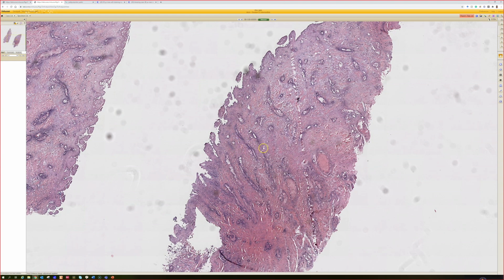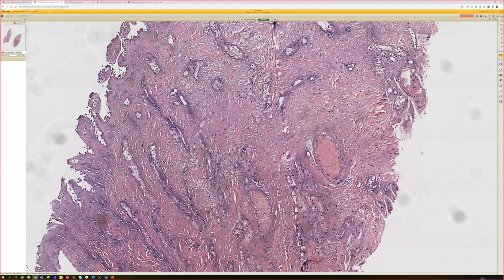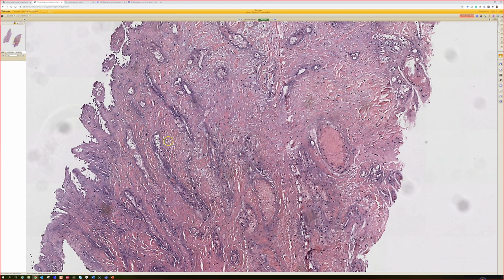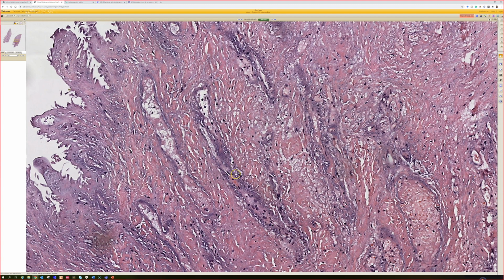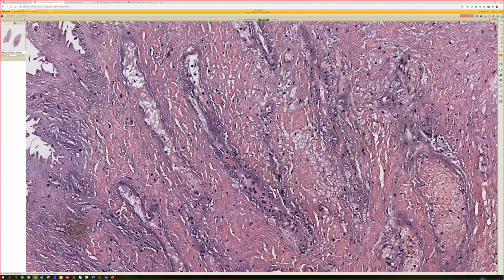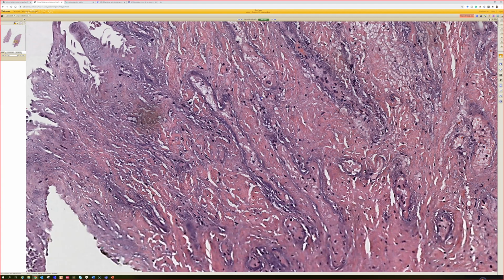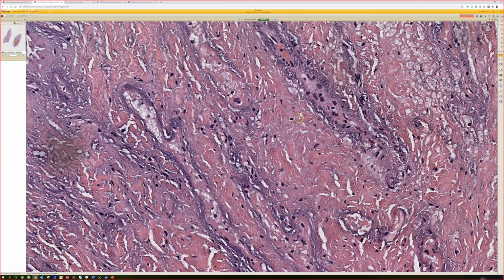And then the tissue here looks pretty, I don't know if it's like devitalized, but then there's these vascular structures throughout, and then there's a bluish haze. So you do know what it is. Good. So what is it? So one thing to look for is inflammation, and there's really not too much. And with that blue haze and lack of inflammation, and the blue haze being around vascular structures, you can think of ecthyma. Yeah, ecthyma gangrenosum particularly.